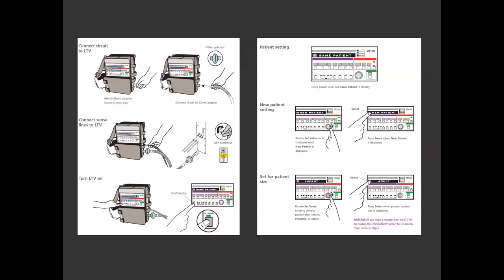It's very easy to start the LTV. After connecting it to the power source, connect the tubing to the ventilator, then connect the sense lines. Turn the LTV on by pushing the ON/standby button located in the left lower corner of the interface. The main display will show the patient setting menu with "same patient ON." Rotate the set value knob clockwise until "new patient" is ON and select. The display will show a setting for patient menu. Toggle with the value knob to the correct patient size — infant, pediatric, or adult — and select. That's all it takes, and you're ready to go.